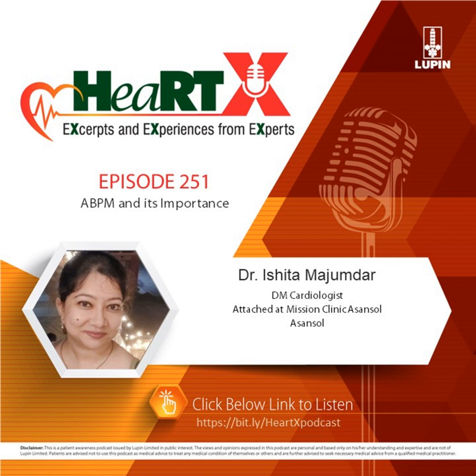It is a better predictor of hypertension-mediated organ damage than office BP, because it is the fluctuation of the BP which denotes or interprets the organ damage. 24-hour ambulatory BP mean has been consistently shown to have a closer relationship with morbid or fatal events, a more sensitive risk predictor than office BP of CV outcomes such as coronary morbid or fatal events and stroke. It can identify white coat and masked hypertension, has stronger prognostic evidence, nighttime readings are available, measurement is in real-life settings, and additional prognostic BP phenotypes can be identified. Abundant information comes from a single measurement session, including short-term BP variability.